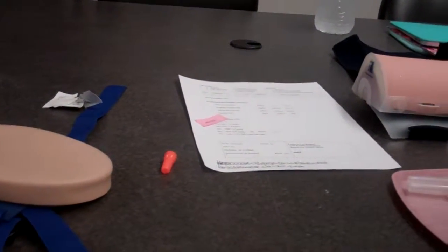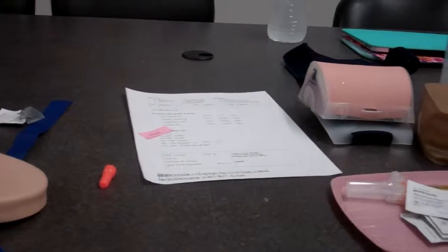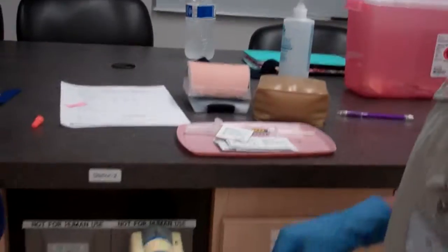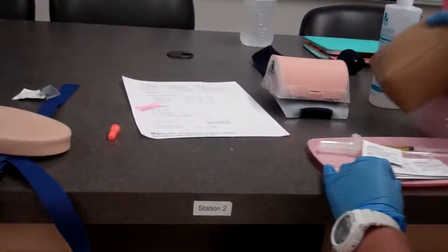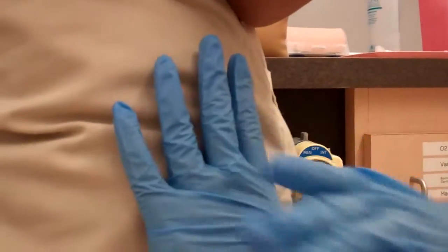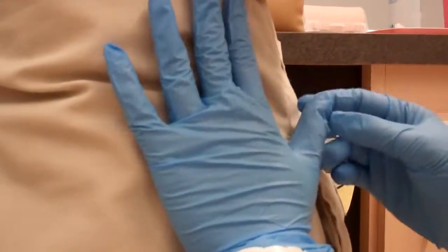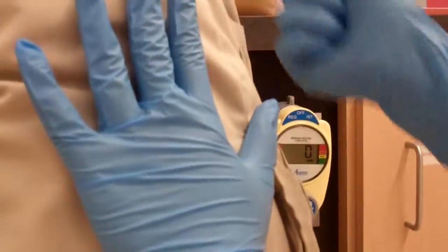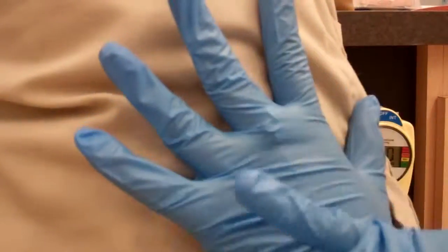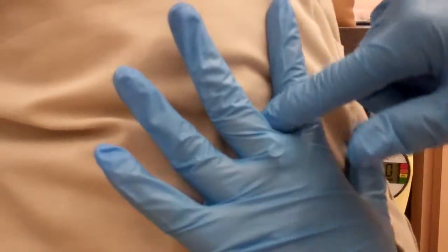So for your Ancef, it is an IM. Is it okay if I insert it into your right ventrogluteal? Yeah, that's fine. Okay. For my patient, I'll put my hand and make sure I feel for the iliac crest. I'm going to hold onto the greater mass of the greater trochanter. Make sure that my thumb is pointing to the umbilicus. My pointer finger should be up to the iliac crest. My hand should fan out, and I should insert right here where I feel mass.